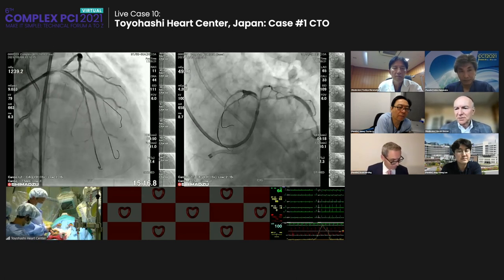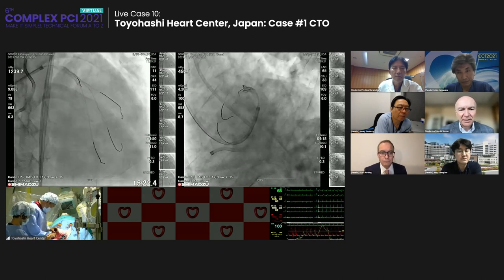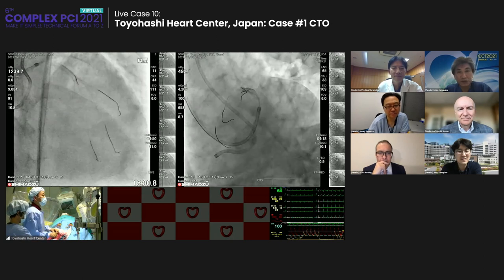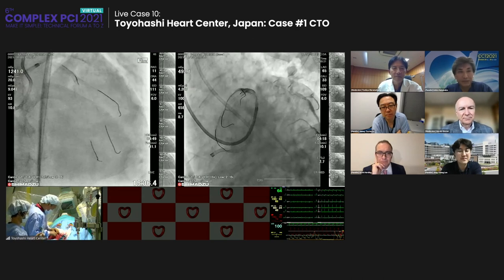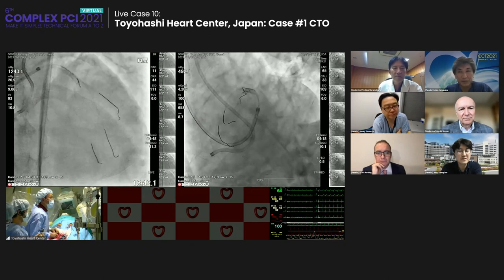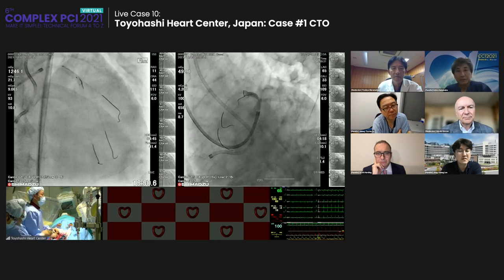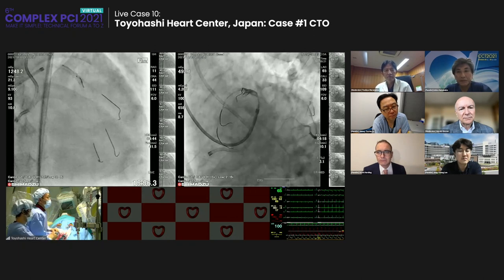Do we have questions regarding Kenya's presentation? Probably this methodology is very important to use the plasma mediated ablation system. So that's why Dr. Kato is developing this concept. So in the future, maybe we can introduce the heartbeat synchronized angiogram, and also that we can introduce the plasma ablation.